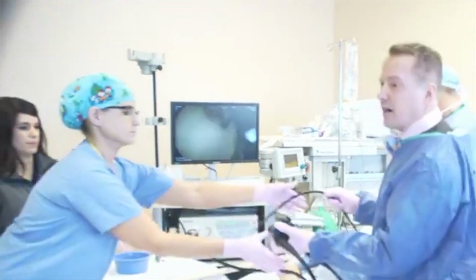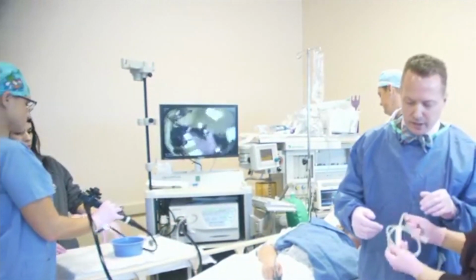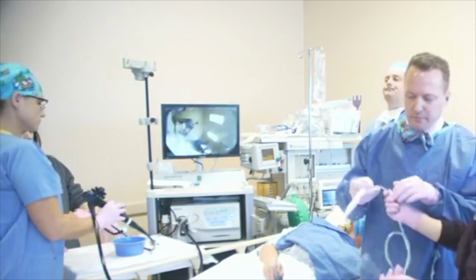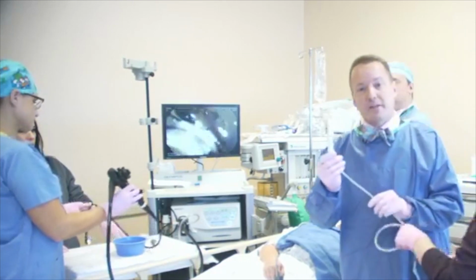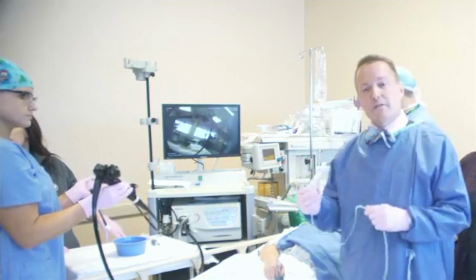The balloon starts out as a non-inflated device, about the size of your ring finger. So it easily goes to the back of the throat. And then once we get it beyond the throat, we'll follow it in as well.